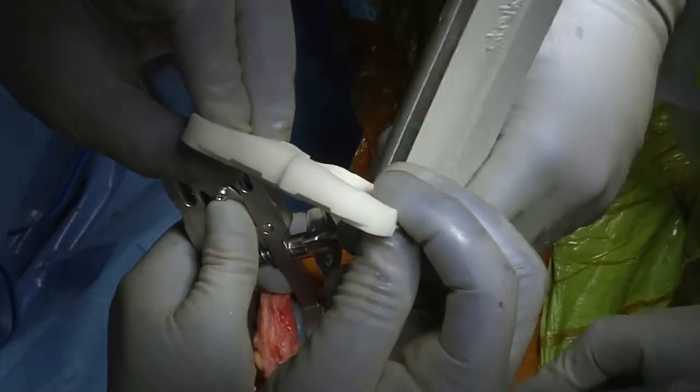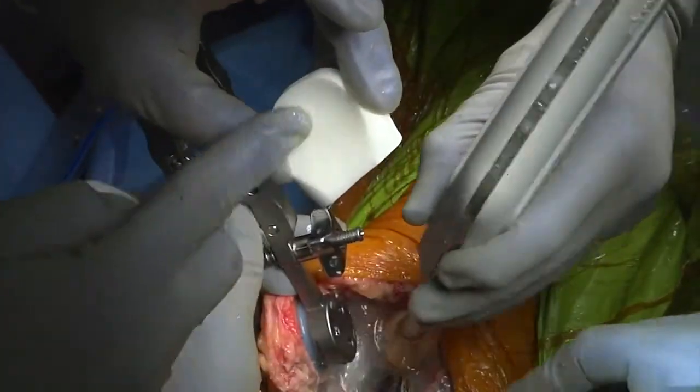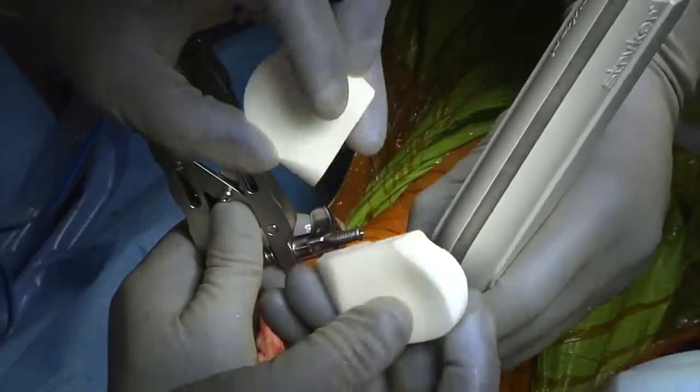If we look at the polyethylene or the bearing surface, there's an offset here. And the reason is that in the real knee, the two sides don't match. One is a little higher than the other. The implant matches that offset. Sometimes it's even, sometimes it's as much as 5 or 6 millimeters difference.